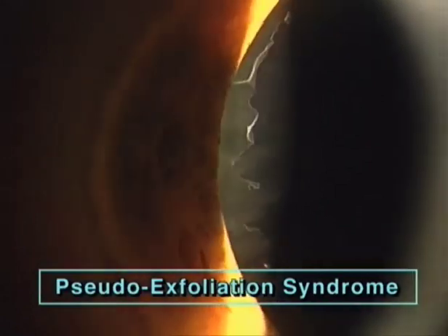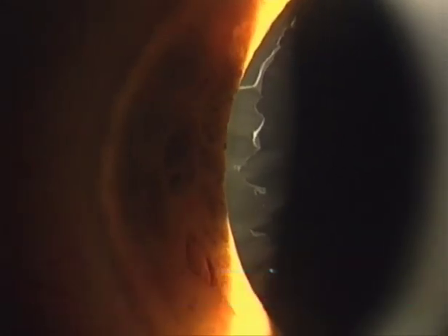This case of pseudo-exfoliation syndrome may serve as another clinical example. In the upper circumference, Schlemm's area shows endopigmentation, and this is the only pigmented part here, while Schwalbe's line and the scleral spur are free. Laterally, a second pigmented band appears, confined to Schwalbe's line, deep black and with a sharp contour. At the bottom, we find even more pigment, at Schlemm's area, at Schwalbe's line, and in addition, a third pigmented band in front of them.